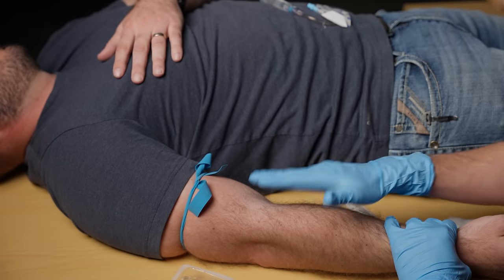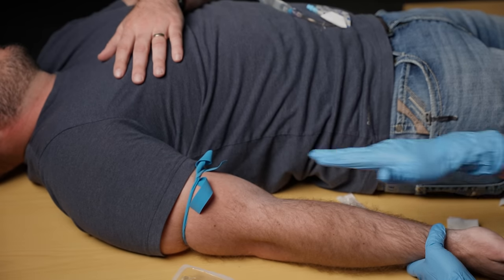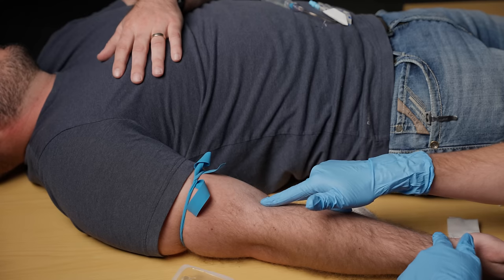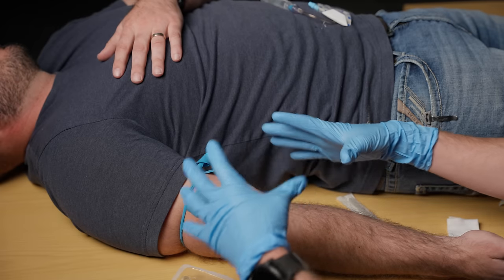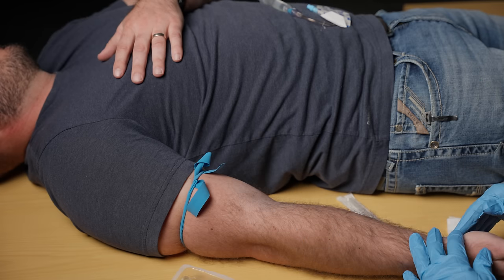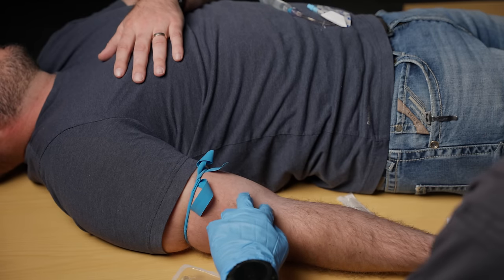For me, I'm starting it up here. Also be aware that if I miss up high, I don't want to start anything lower than that — because if I've infiltrated up here and I'm injecting fluid lower, it'll start going into the interstitial space and won't actually be feeding into the patient. So technically we start low and go high when looking at starting any kind of IV.